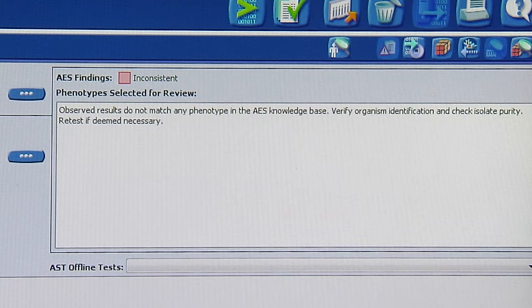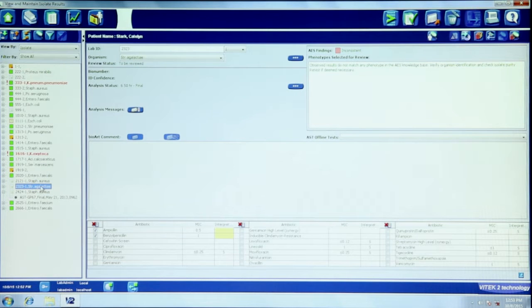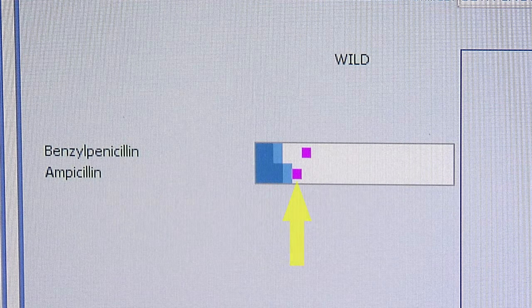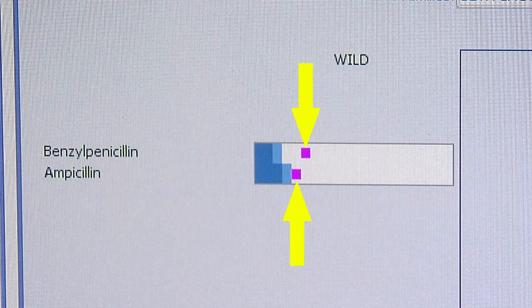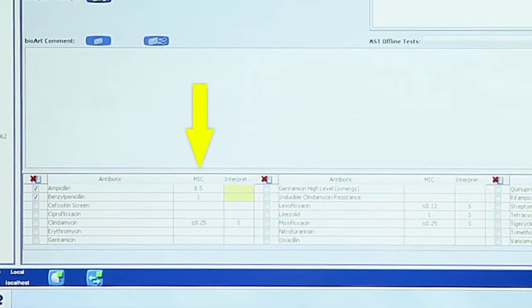Inconsistent results are indicated by a red square in the AES findings area of the View and Maintain Results screen. This confidence level icon signifies that the susceptibility results do not match any phenotype in the AES knowledge base, or there are too many correction possibilities. In the case of inconsistent results, no MIC or test changes are proposed by AES.